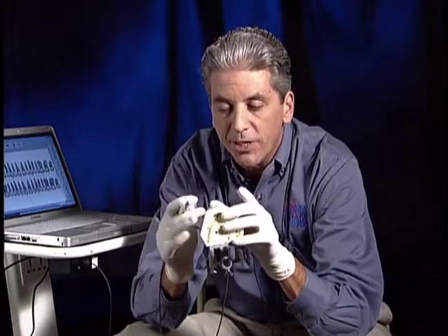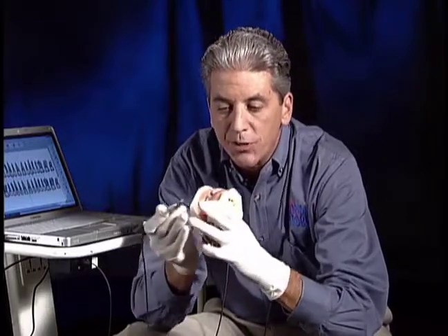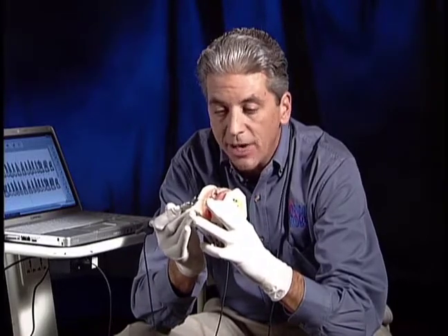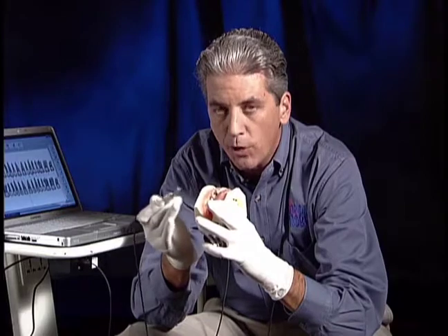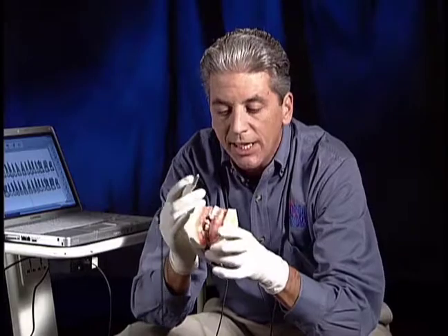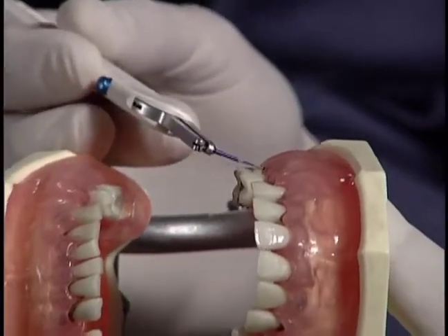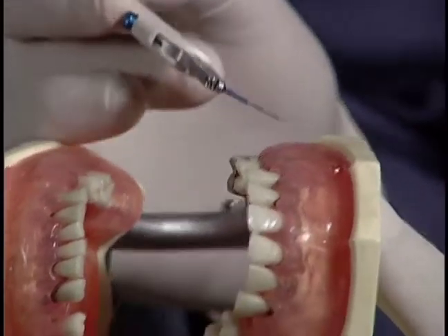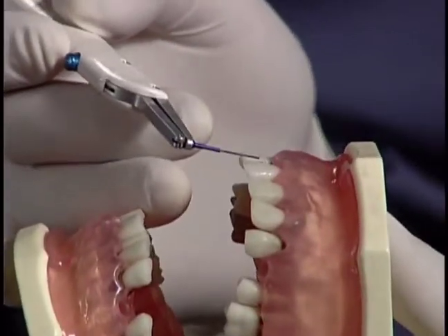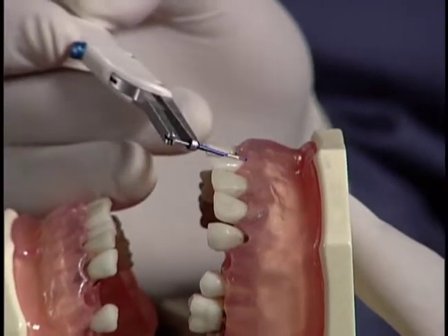The third issue relative to patient comfort is angulation. With this probe, I can't underprobe or overprobe. It is 15 grams. So angulation is even more important because I can't back off relative to patient comfort. In the back of the mouth, I'm pretty much in line with the crown angle and the tip falls into the pocket. As I approach the anteriors, however, the anatomy changes. If I am in line with the crown angle, I'm poking the patient in the sensitive gingiva.